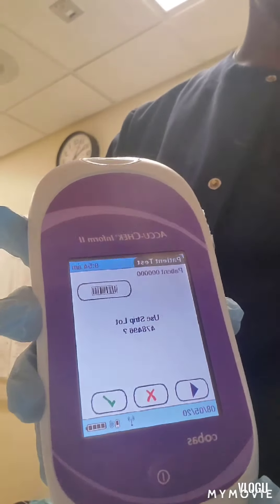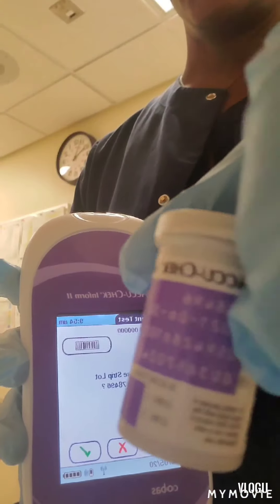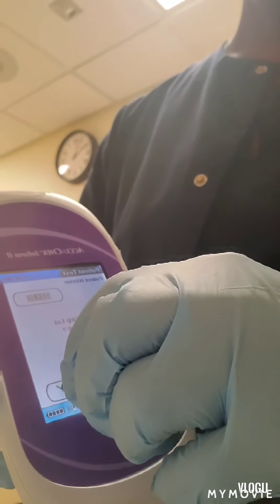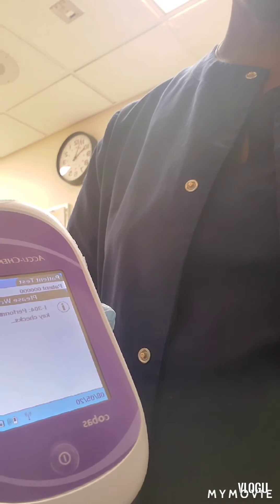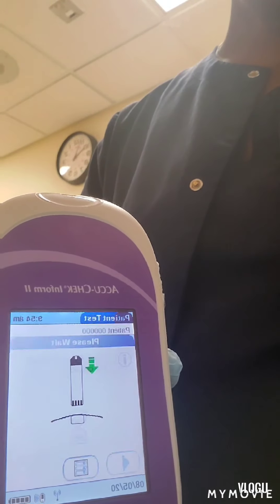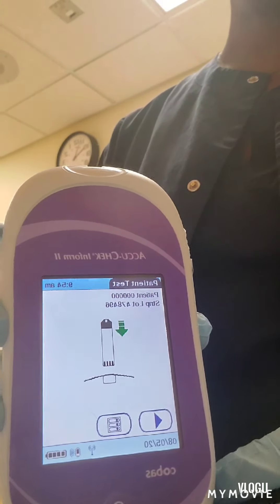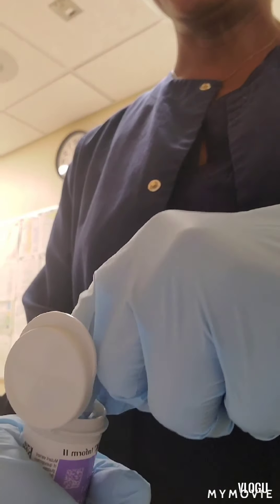Now it's asking us to verify the test strip lot number, which we've already done. You can find the test strip lot number on the side of the bottle. You also need to check the expiration date to make sure the test strips are still good. We push the check mark. Now the machine is saying it's time to insert the test strip into the port, so we're going to take a test strip out of the container and insert it into the port.